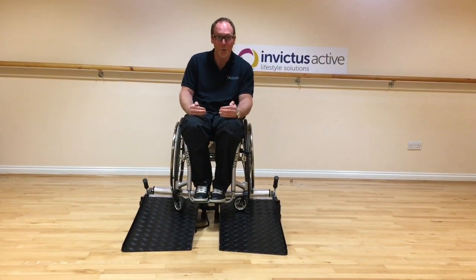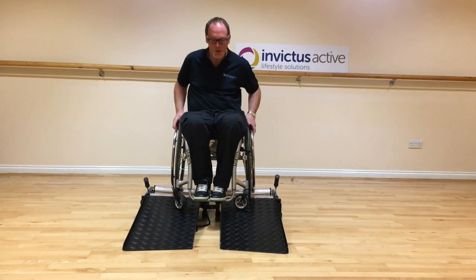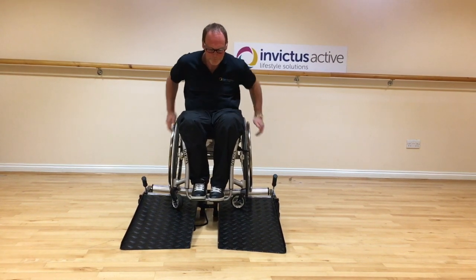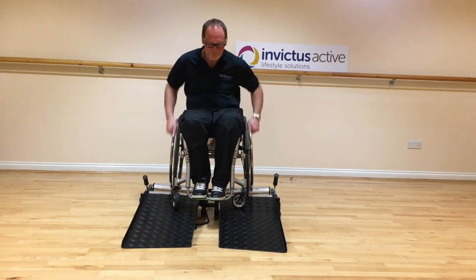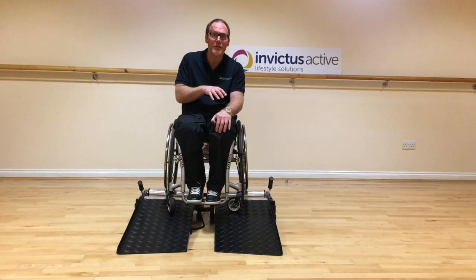Now I've inserted the washers to correct the travel of my trainer. Let's try pushing and see if it's fixed the problem. Having done that, you can see it's corrected the travel.